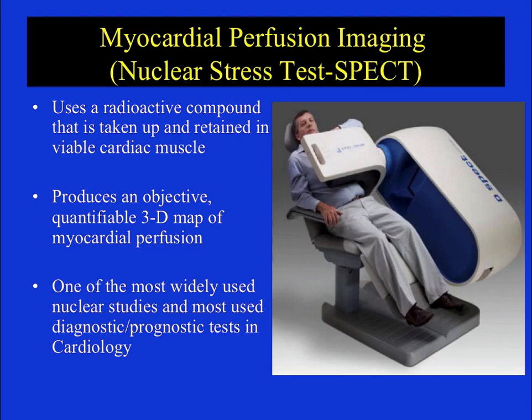Myocardial perfusion imaging is a kind of stress test, like the usual exercise stress test, in which patient is fitted with ECG leads, and we look for any changes in the ECG during exercise. However, in the case of myocardial perfusion imaging, over and above the ECG monitoring, we inject a tracer or a dye in layman term to the patient when the patient is having a peak exercise, and these tracers localize into the myocardium. These tracers are radioactive and they release photons, and these photons are acquired by a gamma camera to form the myocardial perfusion imaging stress image. That is, the images formed when the imaging is done just after the exercise is called the stress image.